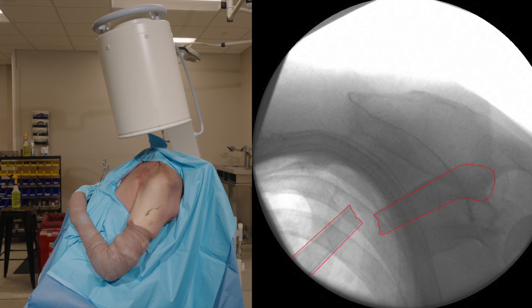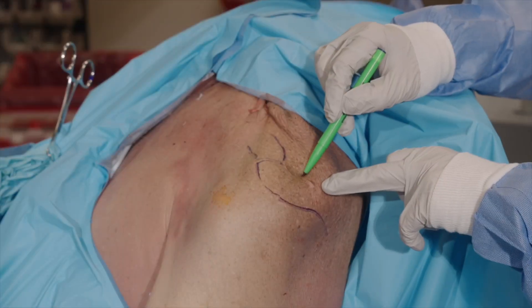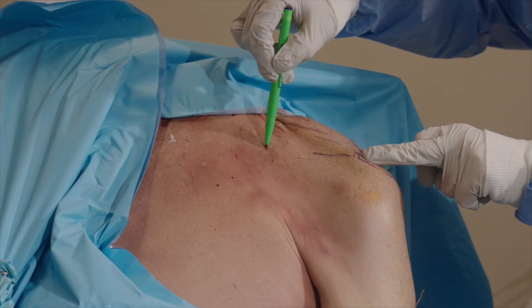Position and test the C-arm in two directions to make sure the entry point, fracture site, and SC joint can be visualized. Identify and mark the anatomic landmarks including clavicle, AC joint, scapular spine, posterior conoid tubercle, and acromion.